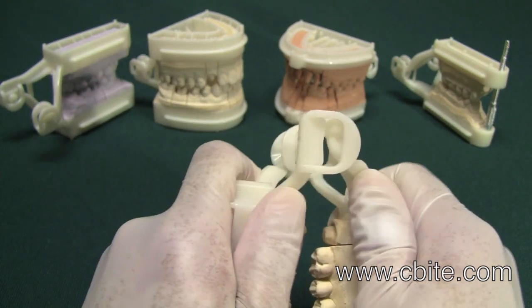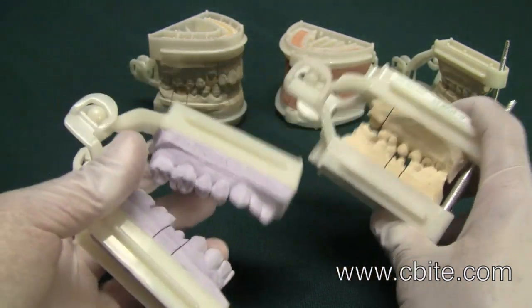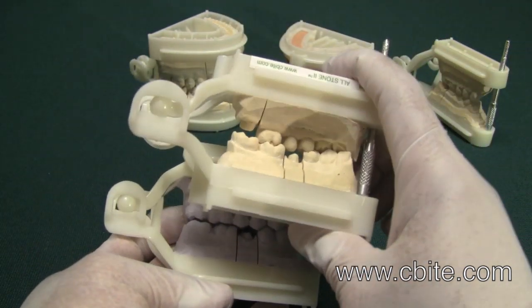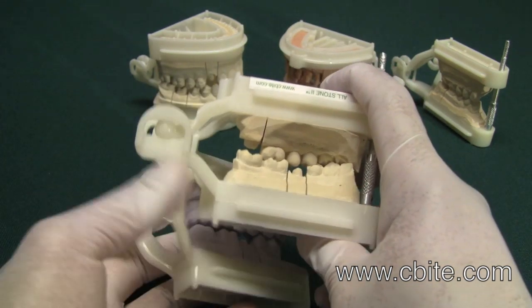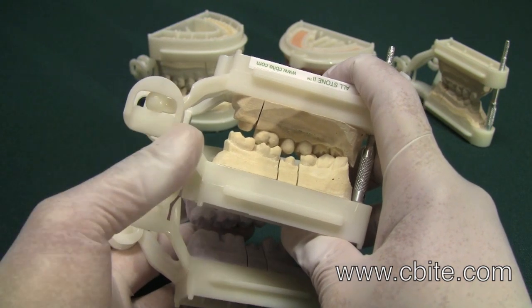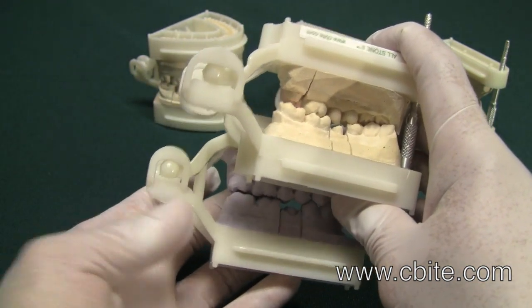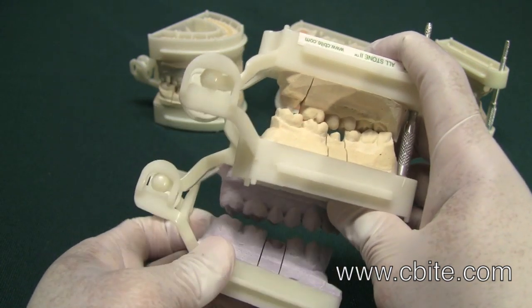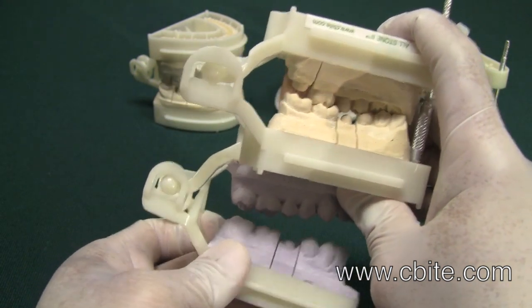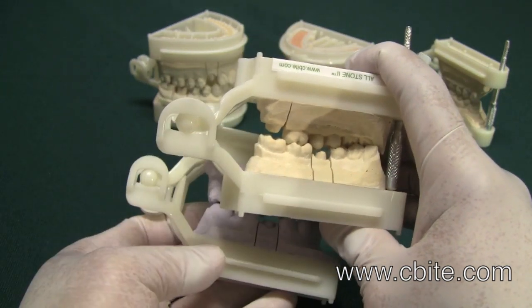You also have a lot more lateral and protrusive movement compared to the Allstone 1 and the Allstone 2. As you can see, look how much wider the ball and clasp design is on the Allstone Neo versus the Allstone 1 — so you don't get as much movement on the Allstone 1 as you would get on the Allstone Neo.